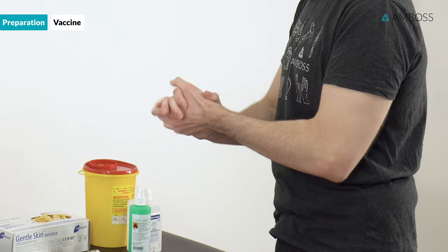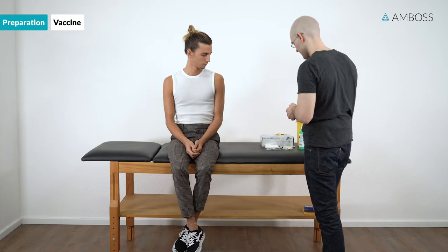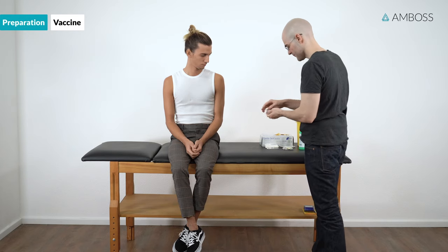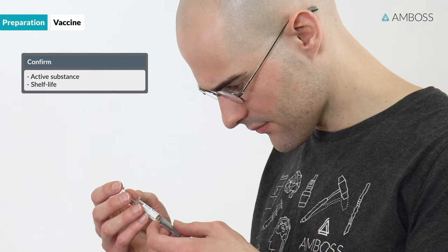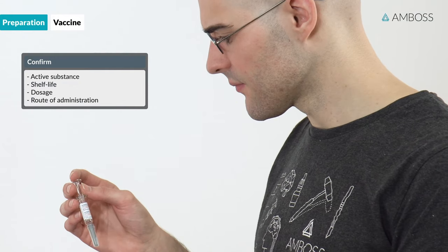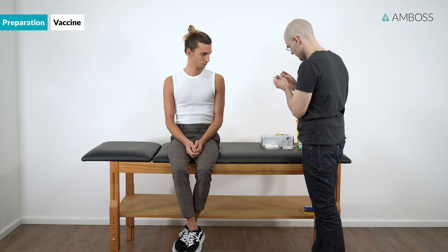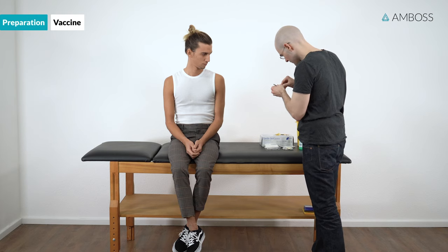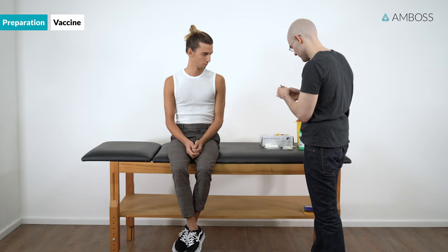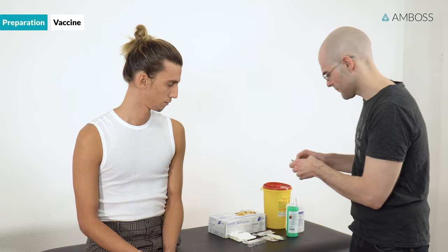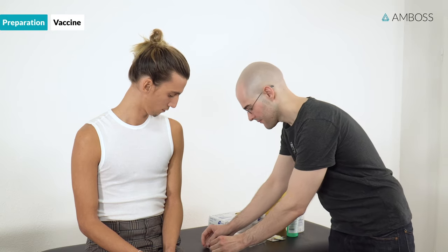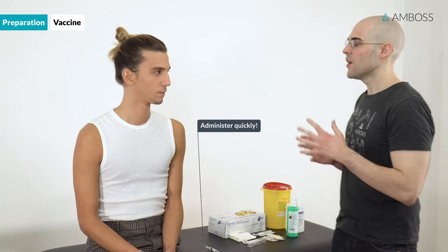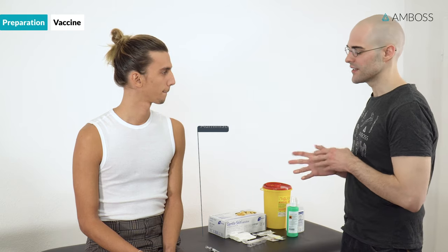Disinfect or wash your hands with soap and water. Many vaccines can be acquired already available in a ready-to-use syringe. Next, confirm the active substance, shelf life, dosage, and route of administration. If it's necessary to mix or reconstitute the vaccine immediately before administration, please refer to the information provided by the manufacturer. Changing needles isn't necessary except if the needle has been damaged or contaminated. Refrigerated vaccines should be administered quickly and shouldn't be stored at room temperature for more than 5 minutes.